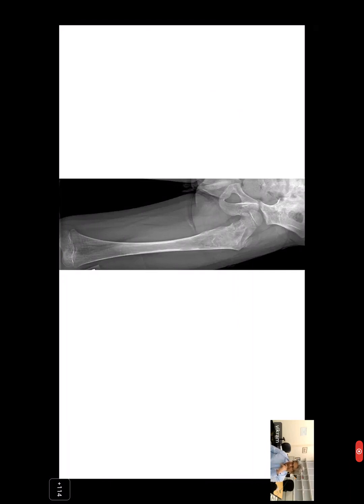So, sir, this is an X-ray of an immature skeleton. The first thing that you have to comment on in the X-ray is the skeleton. You can see the physes are open, no fusion. So this is a kid. So the history I gave you is wrong. I confess, I make up these histories often, sometimes just to hide the patient's information, but in this case I was way off track.